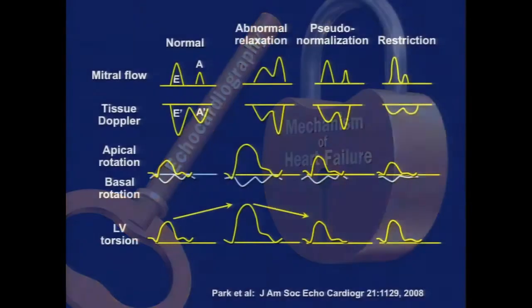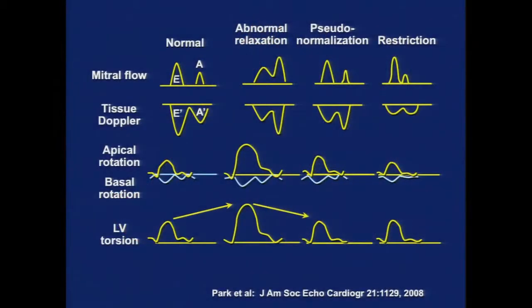And so what is evolving now are classification schemes that look at myocardial mechanics. They may help give clues as to the specific etiologic or pathophysiologic mechanism for the ventricular dysfunction. Now, in most progressive myocardial diseases, including ischemic heart disease, it tends to initially affect subendocardial function, that which is responsible for the longitudinal motion of the LV. And this can be identified early on by a reduction in this early diastolic relaxation velocity, or the E prime velocity.